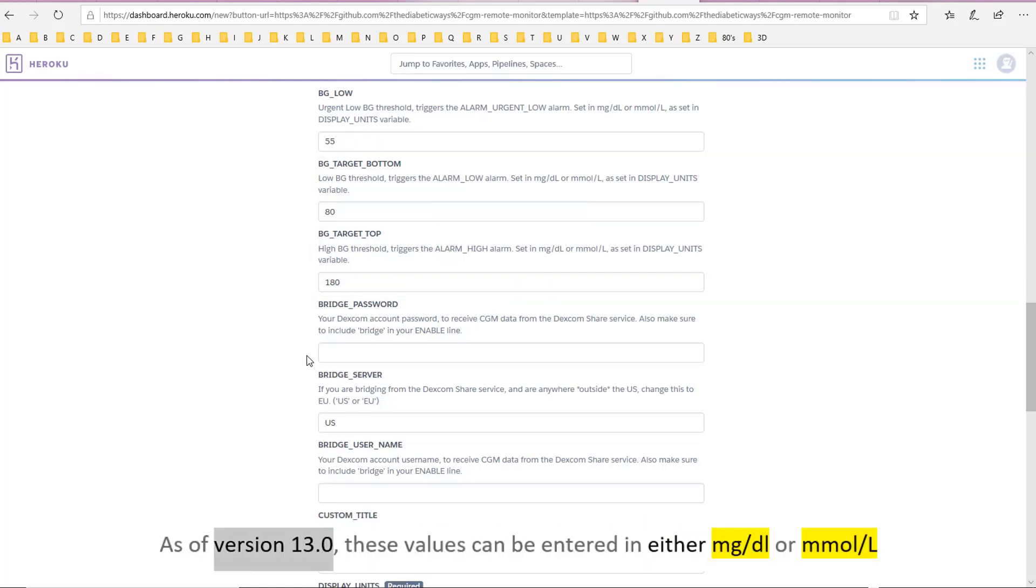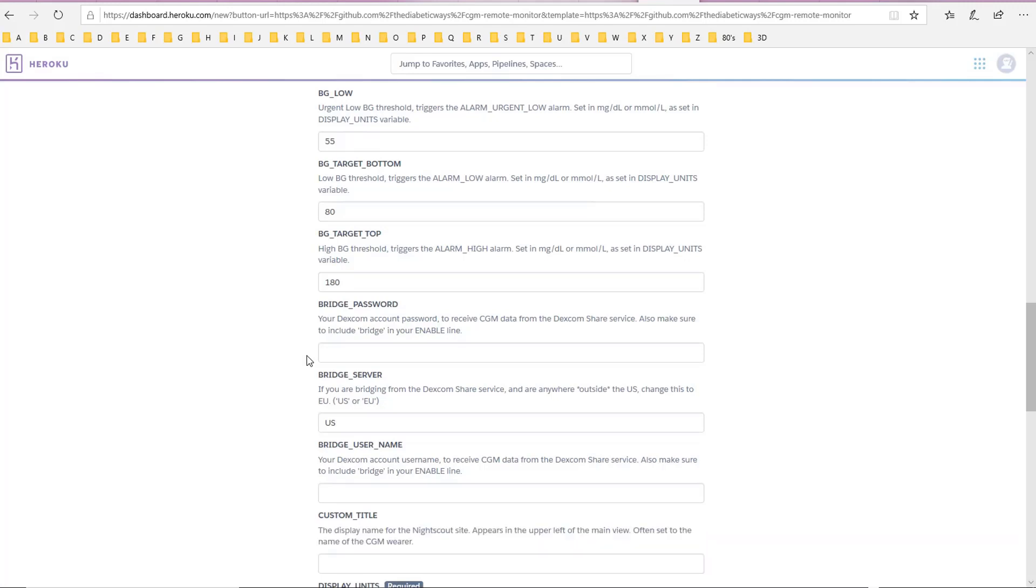As of version 13.0, these values can be entered in either MG/DL or mmol/L.